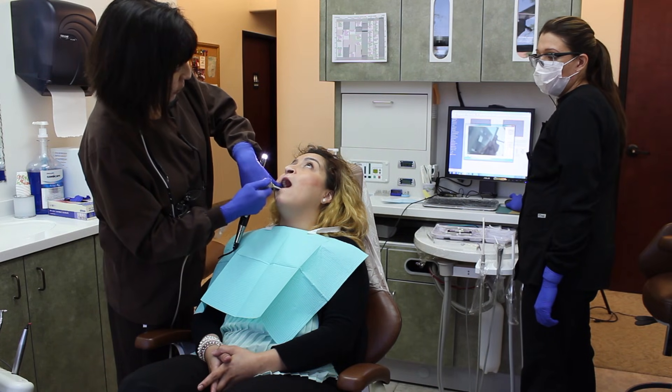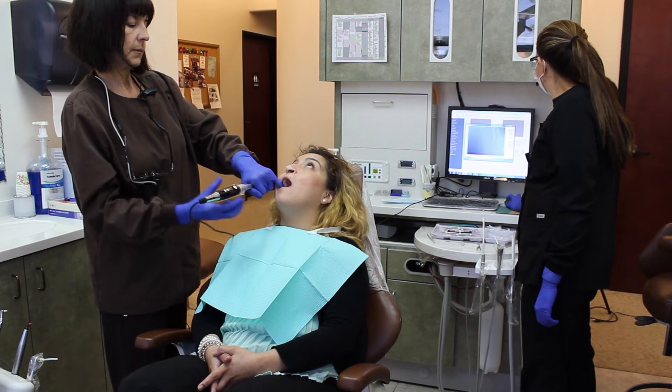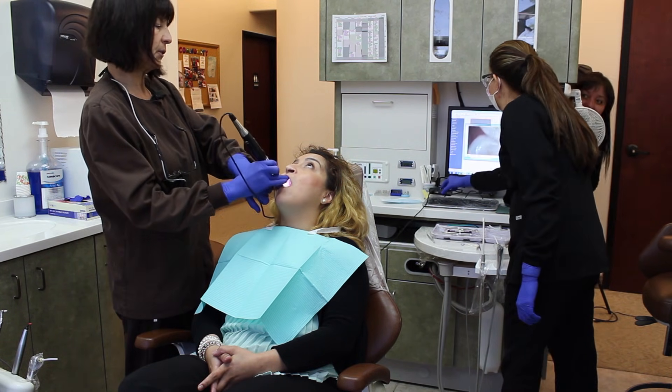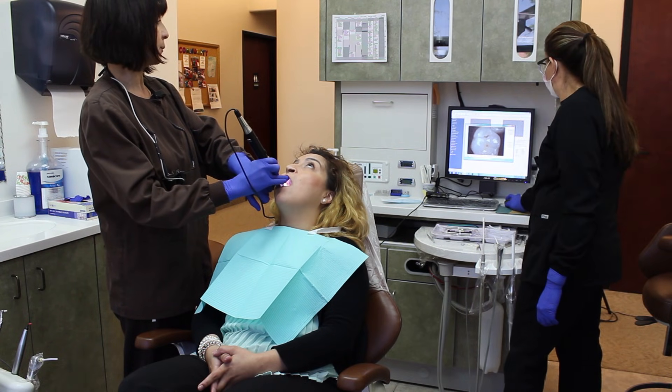I'm going to be using my intraoral camera so I can get a bigger view of what's going on with her tooth, and I can also use it to show her the problem.